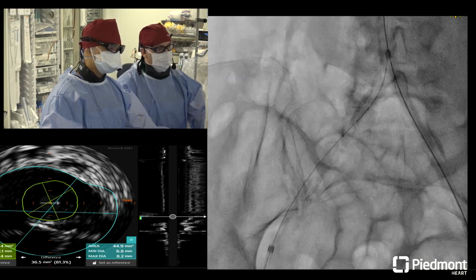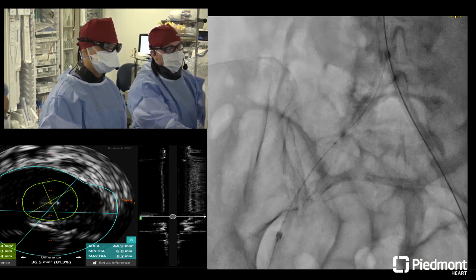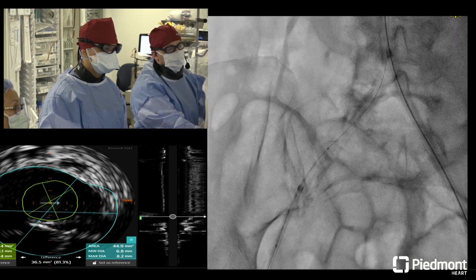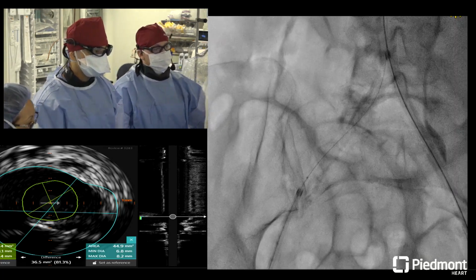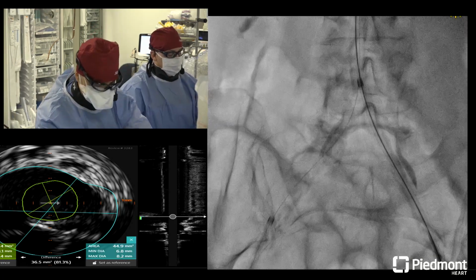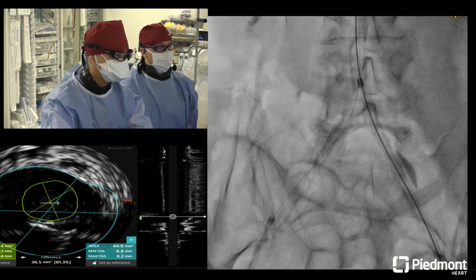So back that up, you're going to advance the sheath? It seemed to. We are seeing them, yeah. Using the balloon as a dilator, but I think we're going to need to switch out anyways. Yeah, come out with it. I'll take a picture from the other side. They might need formal balloon-assisted tracking to really get all the way up there.